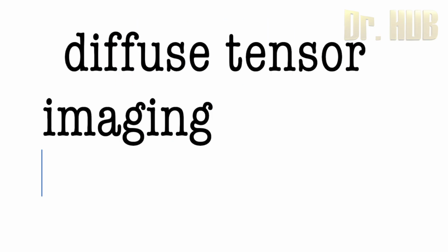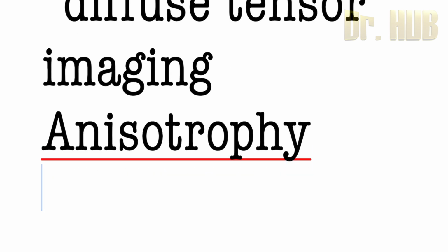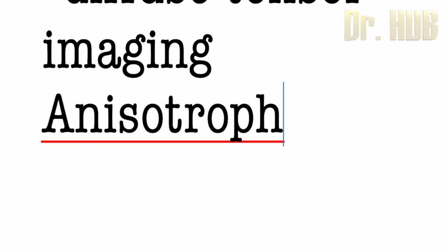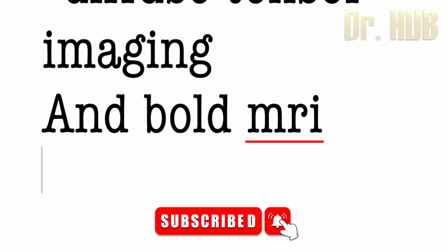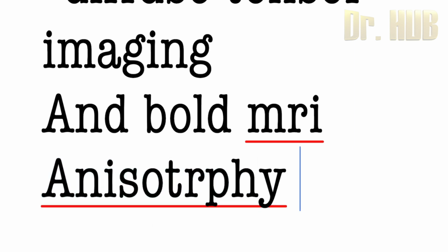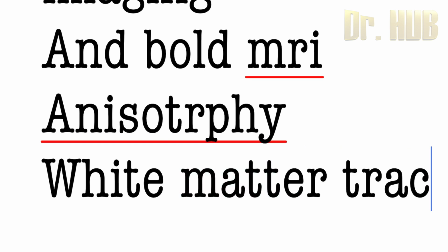Diffusion tensor imaging is totally based on the anisotropy of the white matter. We are going to look at diffusion tensor imaging, and along with it the BOLD MRI. Diffusion tensor imaging is based on the anisotropy, and this is seen in the white matter tracts.